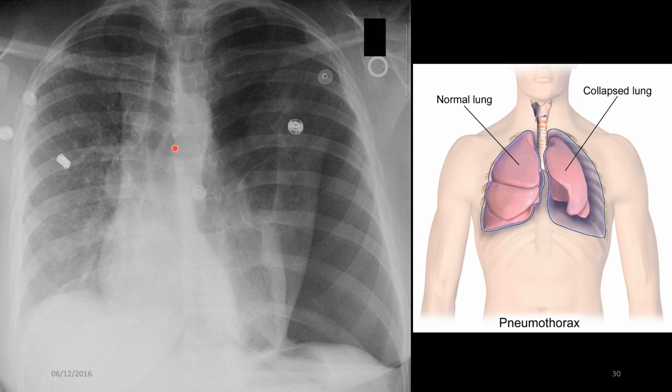It's an absence of lung markings. This is not the best image. It's a very poor quality GIF. But you can see lung markings all the way across, from the right ventricle across to the right side of the chest wall. They've got lung markings going across. And then there's this line, and there are no lung markings across there. That is a classic example of a pneumothorax.